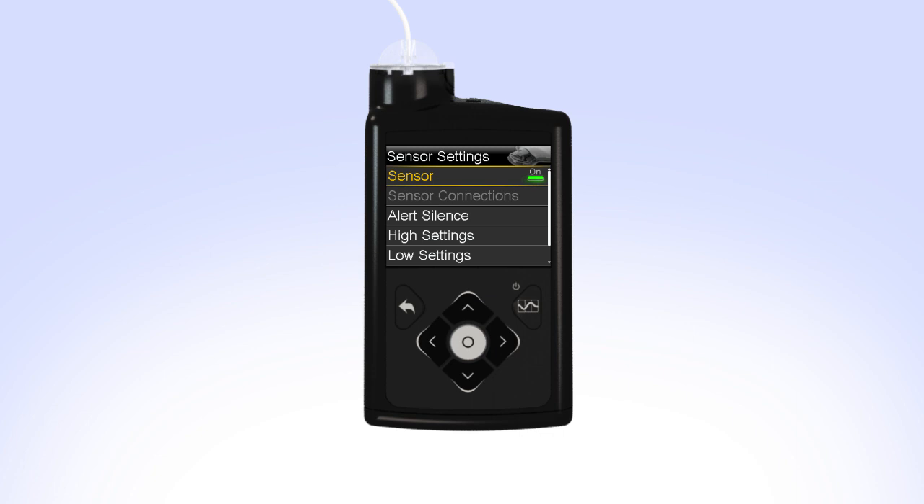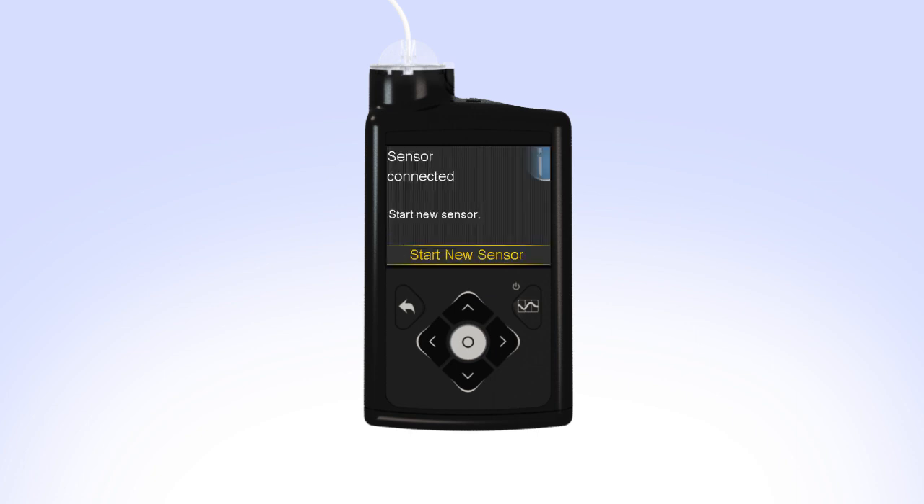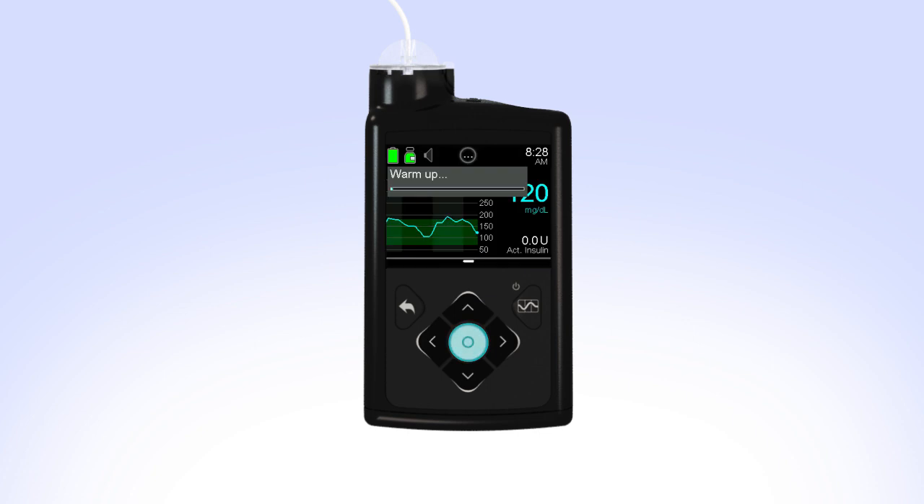Now that the sensor has been inserted and the transmitter has been connected, the pump and transmitter will begin to communicate. When the sensor is ready to be started, your pump will show the sensor connected screen. Typically this screen will display in less than a minute, but in some cases may take up to 10 minutes. Once the screen appears, select Start New Sensor. The pump will display the sensor warm-up started message. Press the down arrow, then Select to clear the screen. Your pump will go back to the home screen and will show Warm Up until the sensor is ready for the first calibration.